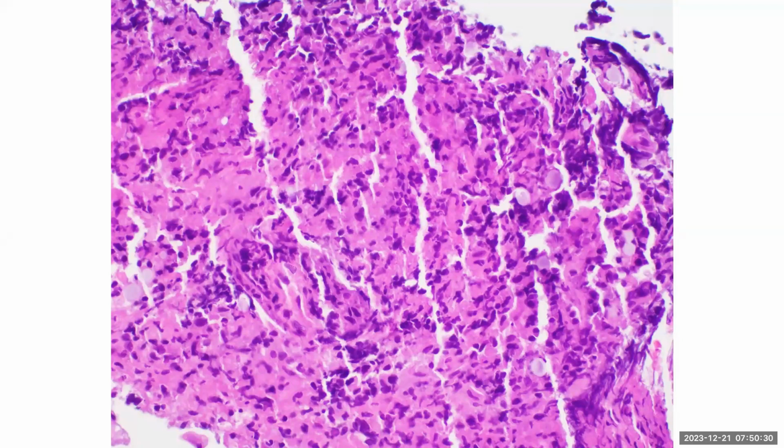Okay. So this would be a difficult frozen if it was sent to frozen. You can see here in an eosinophilic background individual cells that are separated from each other. They don't seem to align or oppose to each other.